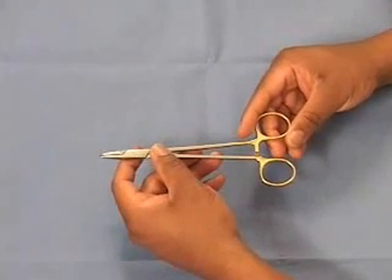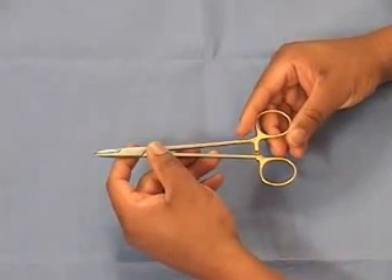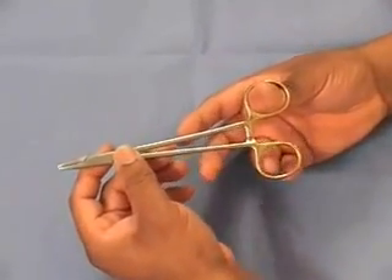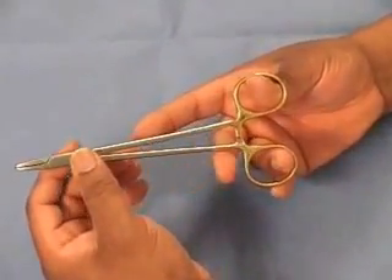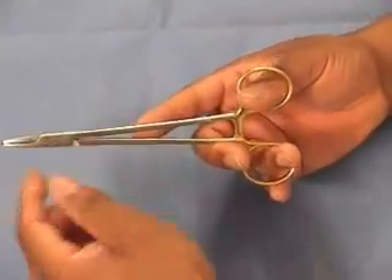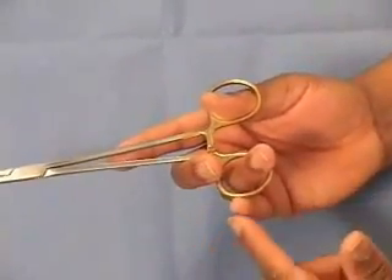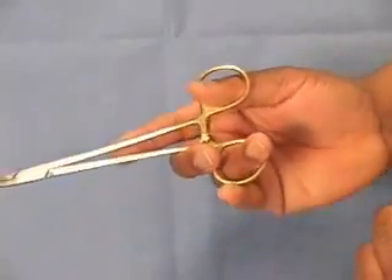Now let's look at the control methods for the needle holder. First, we'll start with the finger control. The thumb goes in the upper ring. The ring finger goes in the lower ring. The index finger goes on the body or shaft of the needle holder. The middle finger and the pinky can add stability to the lower ring.